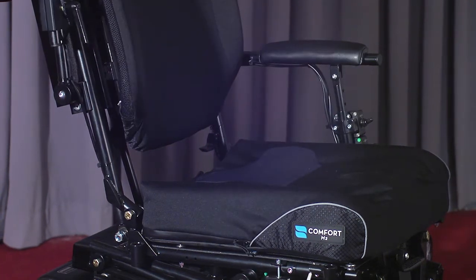For example, if that chair is going to have the proper seat to floor, or if this particular chair is going to be able to go outside, going to go over thresholds, some of the basic needs that they have in their immediate environment. Inches and millimeters really matter, and they matter because depending on the level of injury, depending on the circumstance that brought you to the chair, whether it's something like spinal muscular atrophy or a spinal cord injury or someone with a progressive neuro disease like ALS, the ability to operate the chair, the ability to move the chair, the ability to drive the chair, in many cases may come down to a simple, repeatable, but very small movement, or the ability to transfer out of that chair into bed or into a vehicle may come down to a very minute detail, half an inch about how high the seat is from the floor, or the ability for the armrest to get all the way back behind the cushion to get out of it.